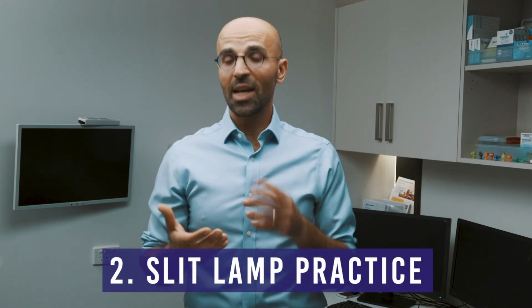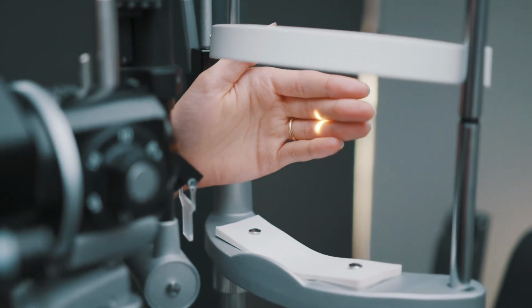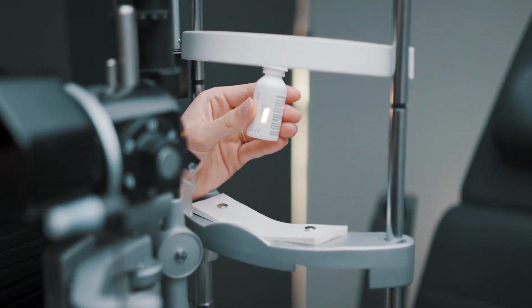If you're on your own, you can actually examine the palm of your own hand, aiming to get a sharp view of your skin creases. You can also examine eye drop containers or other items which contain very small text or features and try to get a sharp view of these as well.